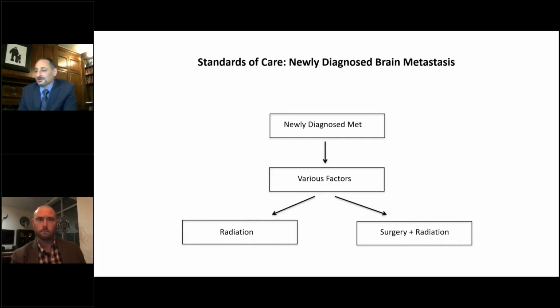Did you go through the MCP for the pontine lesion? Yeah, that's exactly what we did. The location of this was such that that seemed to be the easiest access point. There have also been reports of treating a pontine lesion through a transcortical, transfrontal route, like that of a relatively large pontine tumor. Different ways to approach it.